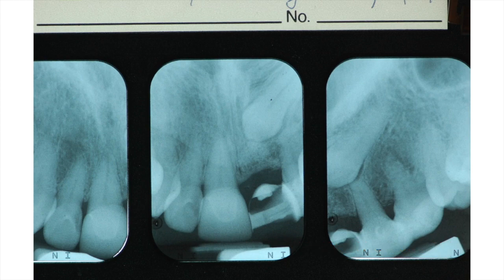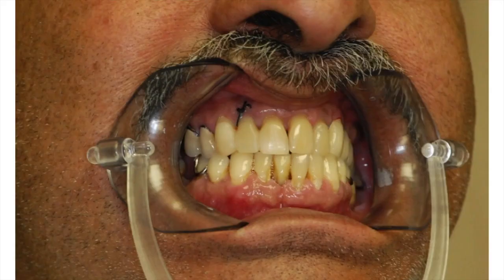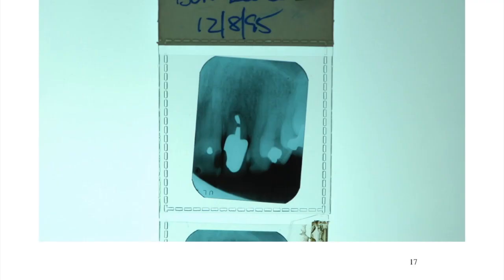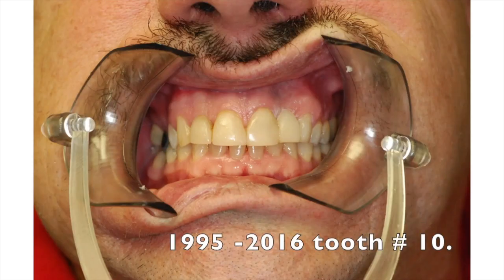Here is a case of an impacted cuspid. Oftentimes we encounter a non-restorable tooth with periodontal disease, so it requires a resin-bonded bridge. At the time of surgery, I'll create an ovate pontic and embed that into the extraction site. Here we have a lingual view of the finished resin-bonded bridge. It's as simple as extracting the tooth and then placing two class III composites in the central and the cuspid, bonding the tooth in place.